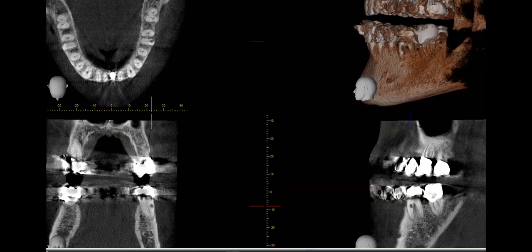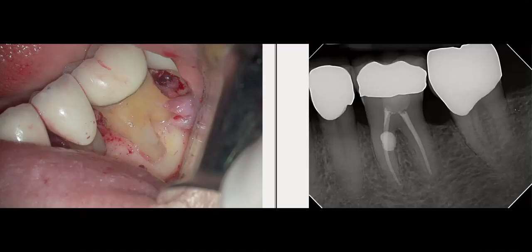Treatment options were presented to the patient, and he elected to retain the tooth. This case is best handled as a combined root canal and resorption repair in one appointment, primarily because I do not want leakage from the resorption into the mesiobuccal root while waiting to reappoint the patient to complete the surgical repair. On the left is the completed procedure.